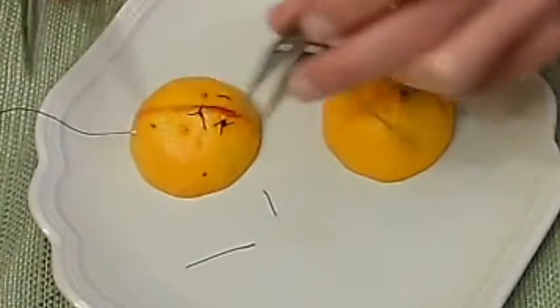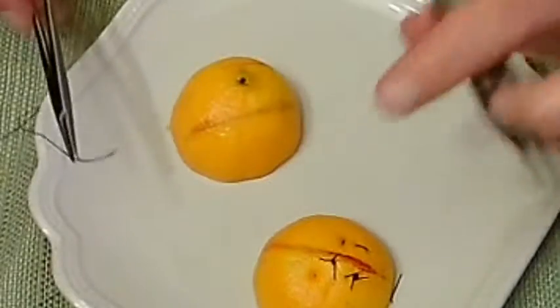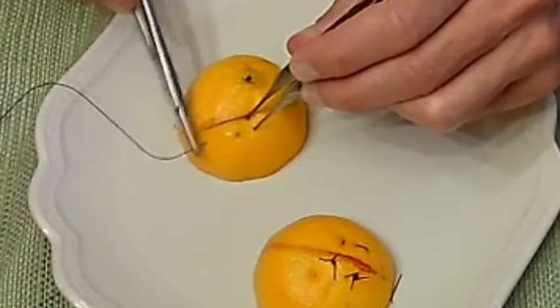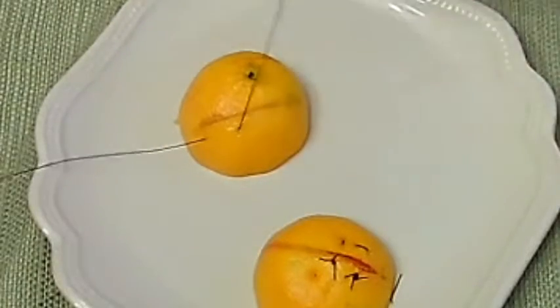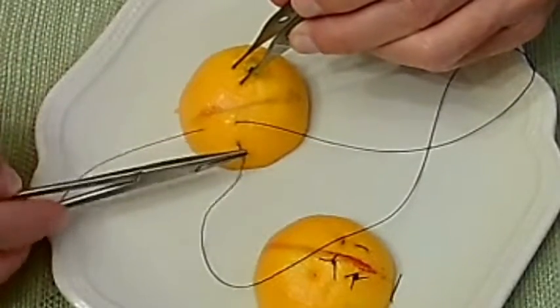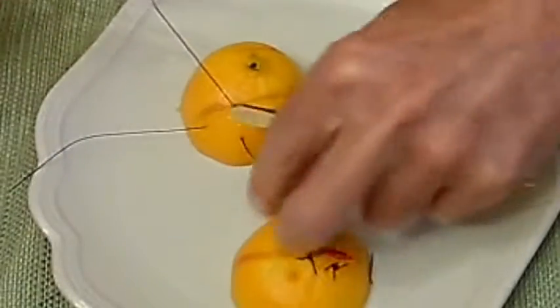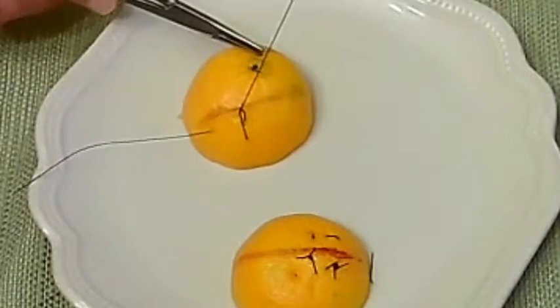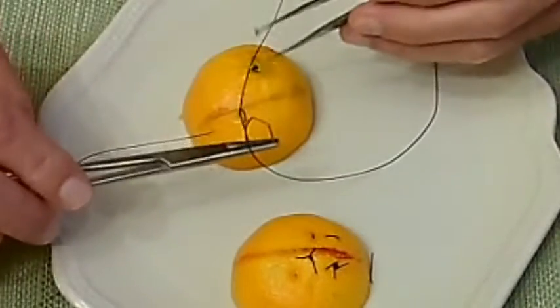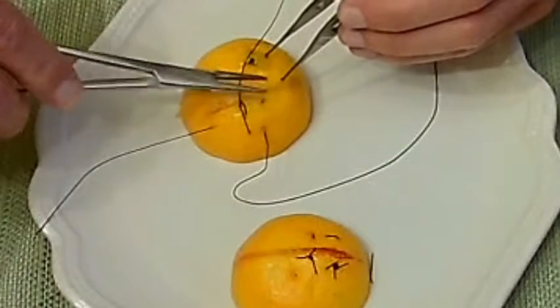Now here's one I wanted to show you in case you're ever in this situation — if you have to sew a tendon. Pretend that we're using a different orange, that the torn tendon end is on the left of the screen. You went in through the torn end. We're doing the Krakow suture — K-R-A-K-O-W. You put the loop over the top; this is a locking suture, so when the suture pulls, it clamps down and locks on the piece of tissue it's around. You lay the loop down so the end of the needle comes out through it, and you pull it up.